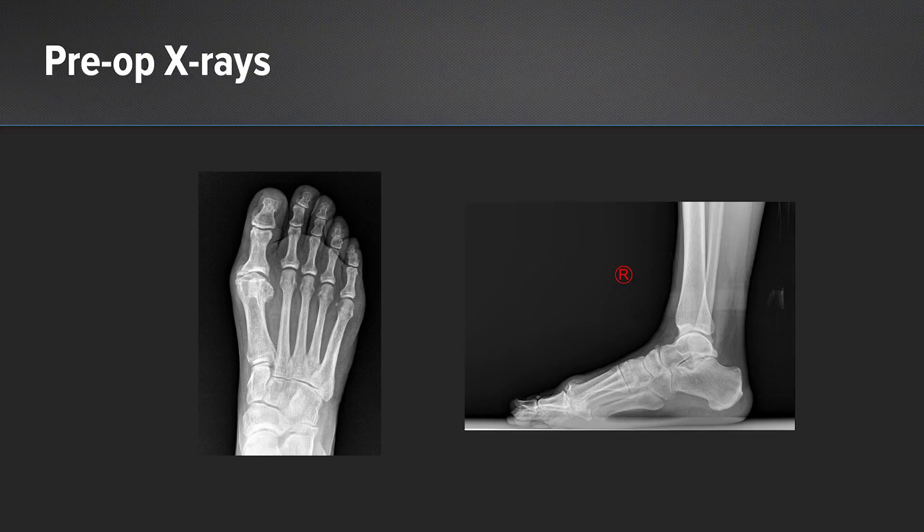The procedure itself begins with joint preparation by reaming the joint appropriately and removing any osteophytes along the dorsal or medial aspects of the first metatarsal in particular. It is important to free up the sesamoids from the first metatarsal as well in order to mobilize the sesamoids. This is where the graft will slide in between the sesamoids and the first metatarsal along the plantar aspect.